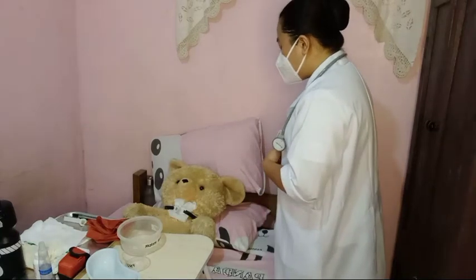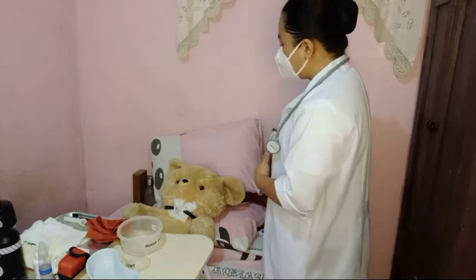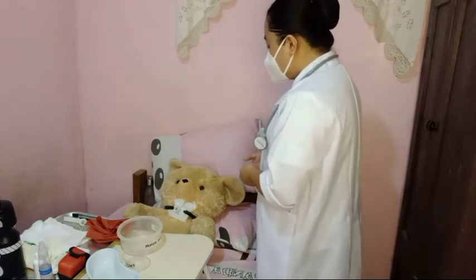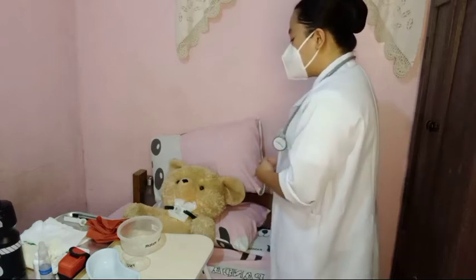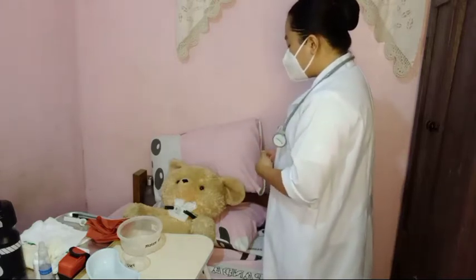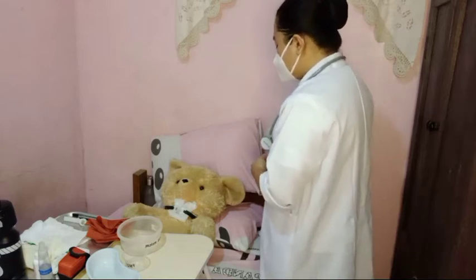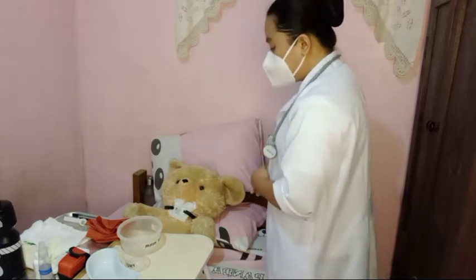Good day, ma'am. I'm Zarah Gabriel and I will be your student nurse for today. Can you please tell me your name? Okay. So, Mrs. Bear, today I will be providing a procedure which is tracheostomy care. Tracheostomy care is done to prevent infection and to maintain airway patency. Will that be okay with you, ma'am? Okay.